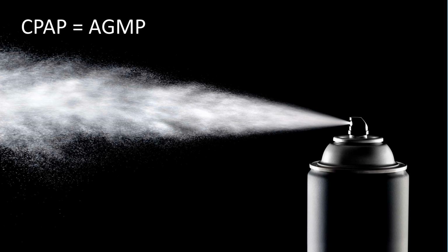What you're required to have donned during AGMPs depends entirely on your patient's presentation, recent history, and clinical suspicion of a transmittable respiratory illness. Basically, it's going to boil down to this. If you suspect that your patient is symptomatic of a transmittable respiratory illness and requires an AGMP for treatment, you are required to be wearing appropriate eye protection, a fitted N95 or half mask, and the usual gloves while performing this procedure.